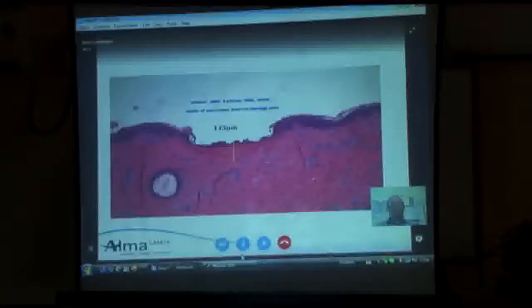And here is another example of a single fractional erbium laser damage on the skin: evaporation of the entire epidermis layer of the skin with some secondary thermal effect deeper into the dermis. And this is an example, a close-up look, of a fractionated ablative CO2 laser.